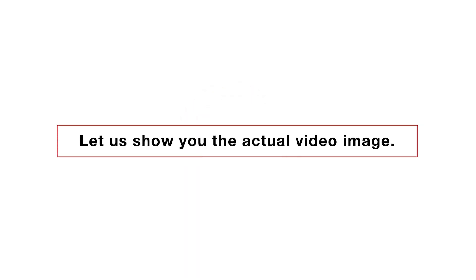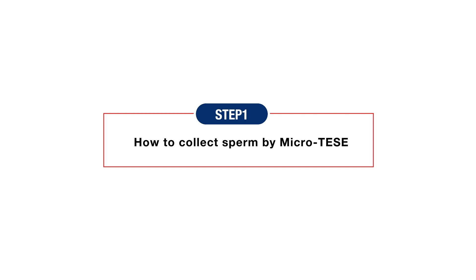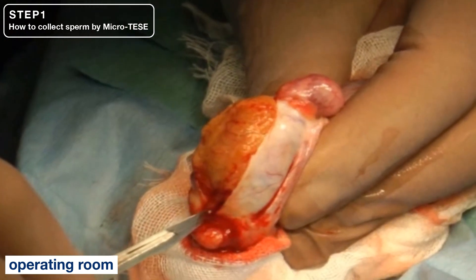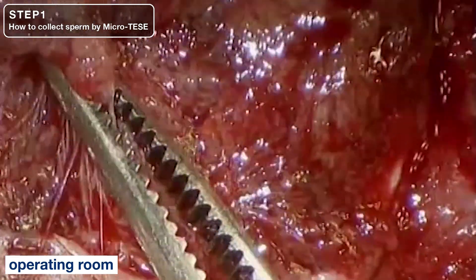Now let us show you the actual video image. Step 1: Micro-TESE. Select the seminiferous tubule with Micro-TESE. The seminiferous tubule is opaque, thick, and bent. Some parts look homogeneously elongated.